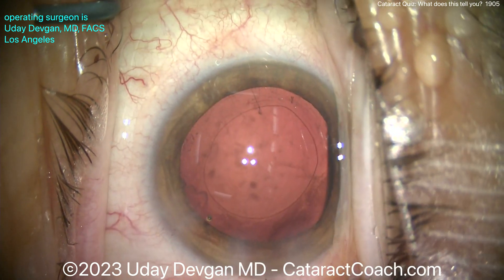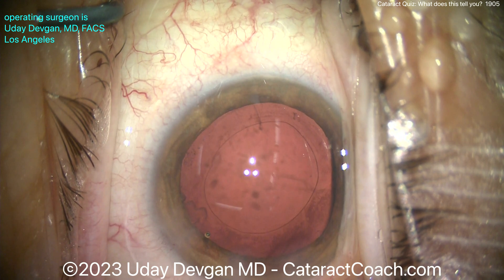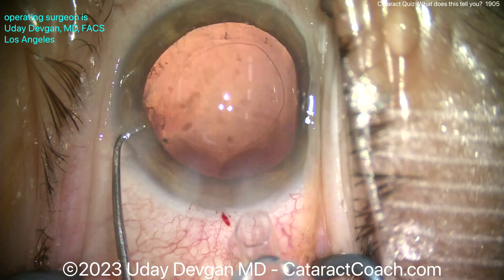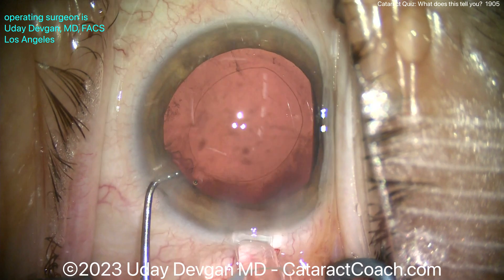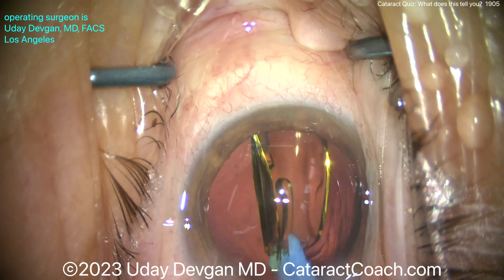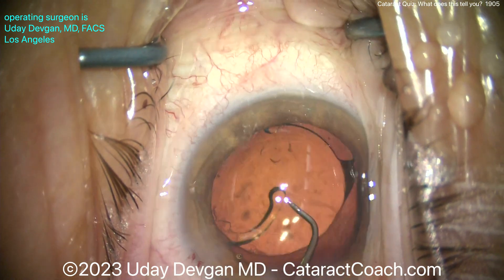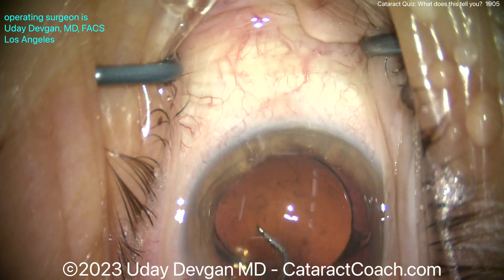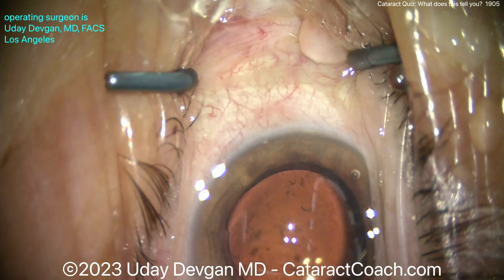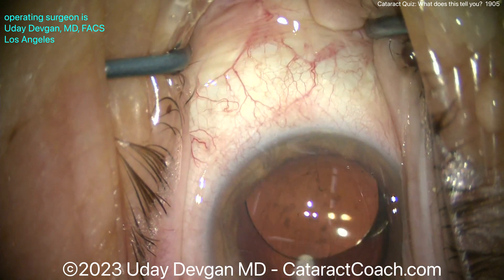You can put any lens you want here. One good option is a single-piece acrylic lens. Some people would say no — put a three-piece lens with haptics in the sulcus and capture the optic behind the rhexis; that works too and helps prevent phimosis. But I think we'll be fine here — this patient has a nice CTR in position, really helping to bolster the capsular bag. Here comes the lens being delivered into the capsular bag; this patient is a hyperope so we have a higher-power lens. Since you already have a CTR, the exact orientation of the IOL doesn't really matter. If you were putting a three-piece lens in the bag without a CTR, you'd want to orient the haptics at the area of zonular weakness so each haptic acts as a bolster.